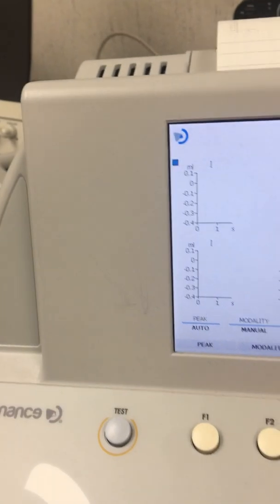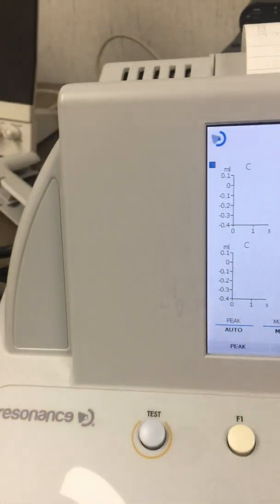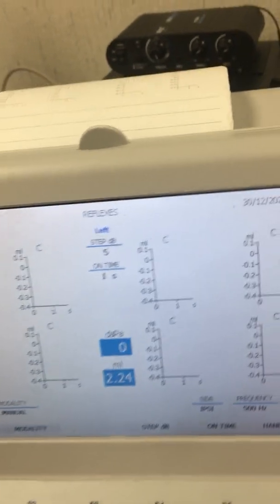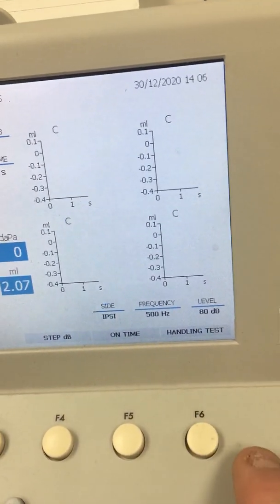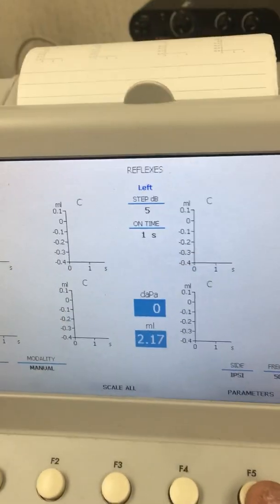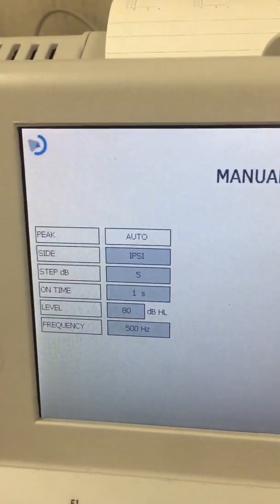We're going to do the left side, so make sure you have it on the left side. We're going to do ipsy. Then I want you to go to F6 handle test and F5 for parameters, and you can set your peak.